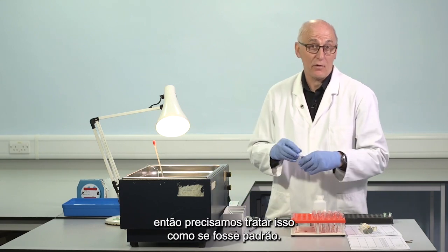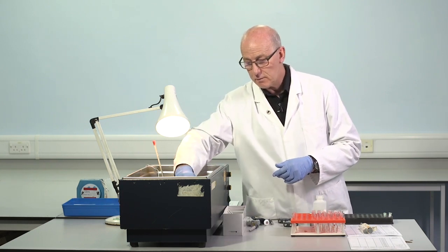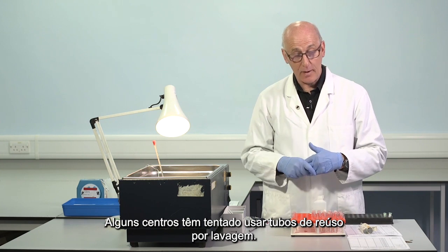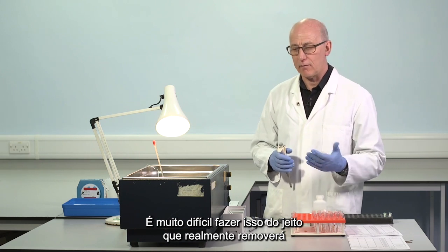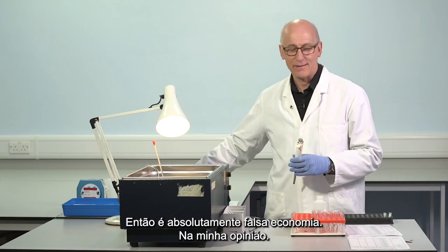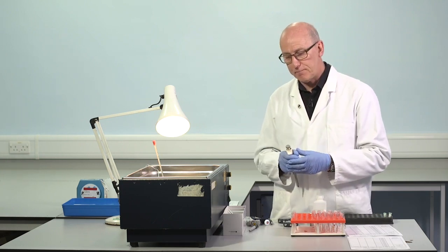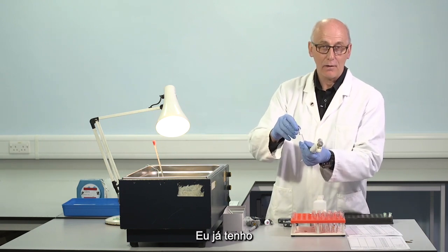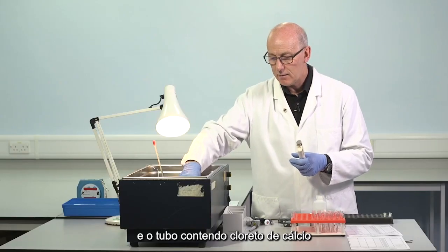So we need to treat this as though it were a standard now in a factor VIII assay. So 3 disposable glass tubes. These should not be reused. Some centres have tried to use reused tubes by washing. I absolutely recommend against doing that. It's very difficult to do this in a way that really removes all the clot, the factors, and all the detergent used for washing. So it's absolutely false economy in my opinion. It introduces many problems. So single-use glass tubes. In the water bath, I already have a tube containing APTT reagent and a tube containing calcium chloride.